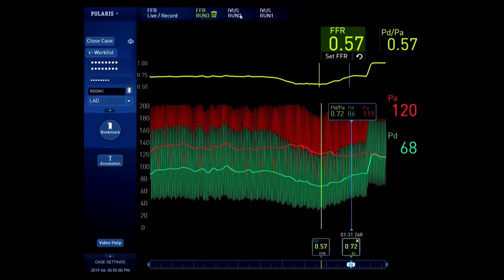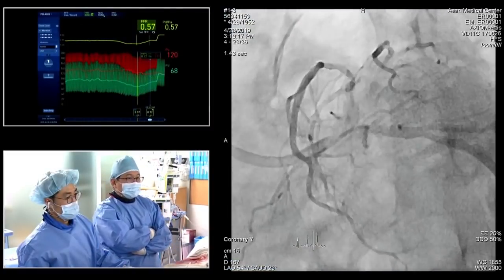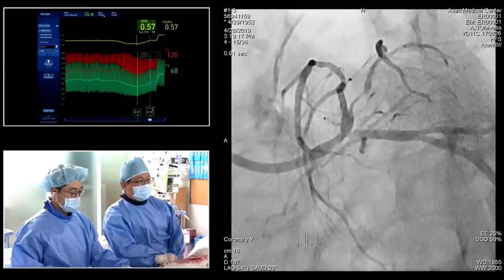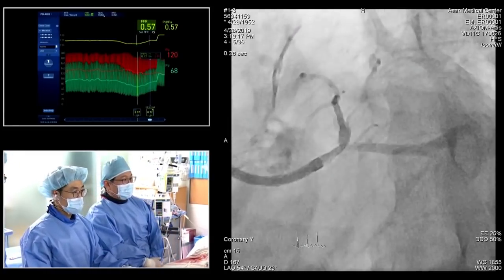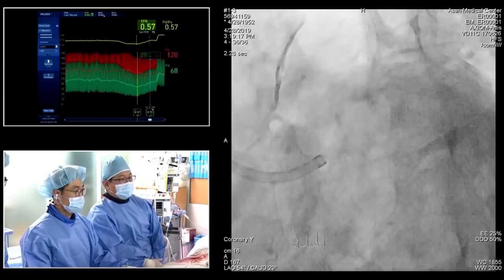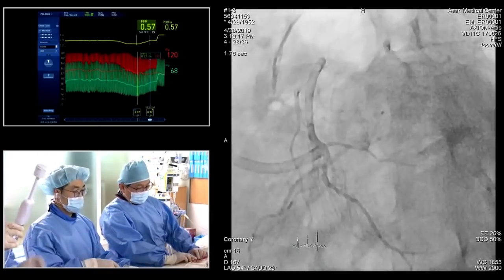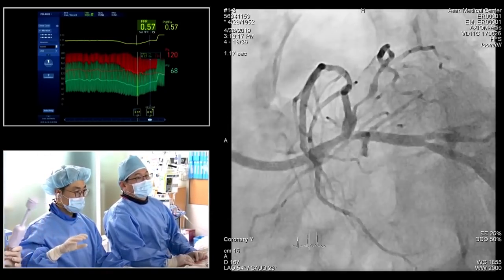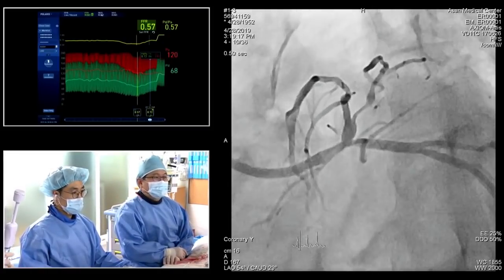So I think the left main is very tight, very significant, and associated with very diffuse LAD disease. So I want to focus on the left main bifurcation first, and if possible, I'd like to treat diffuse LAD disease by medication. I think the SYNTAX score is 47, right? Yeah, 47. A good candidate for surgery too, right?